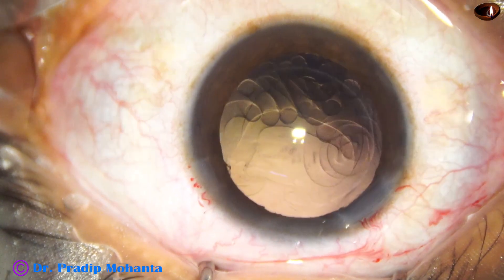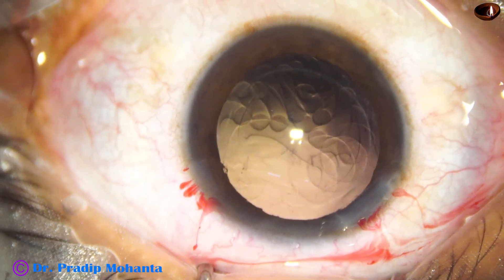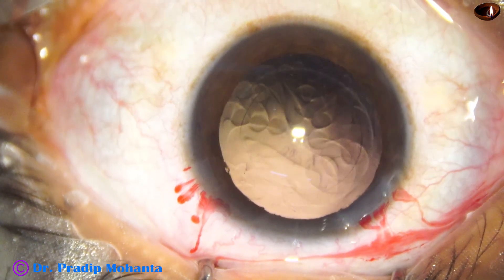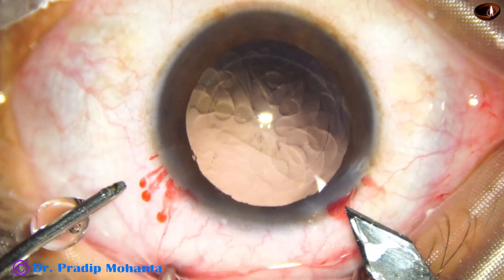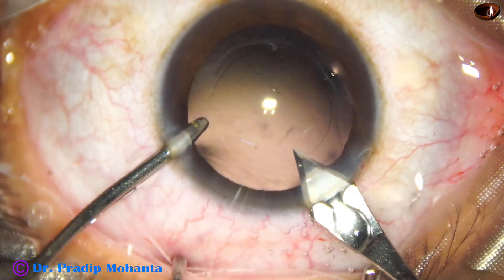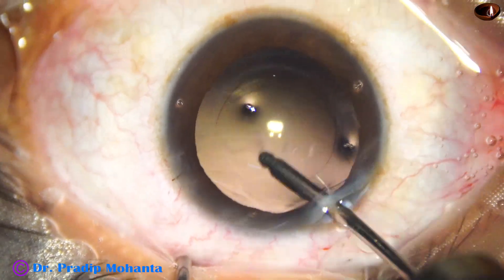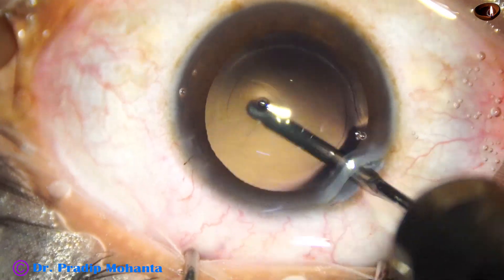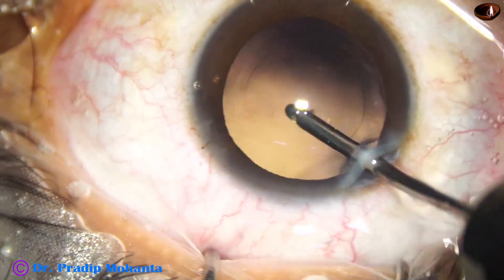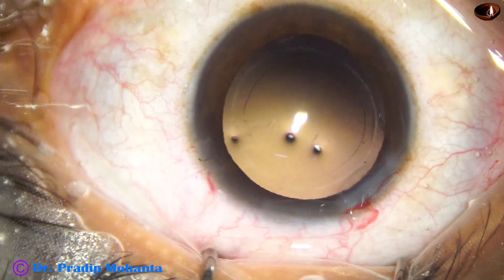We can see that there are some cells sticking to the posterior capsule — we must remove these cells. I enlarge the main incision a little bit because I am going to use a B-cartridge. I then take the irrigation cannula of bimanual IA and, by the irrigating jet of fluid, polish the posterior capsule nicely. Whatever lens cells stick to the posterior capsule get dislodged.